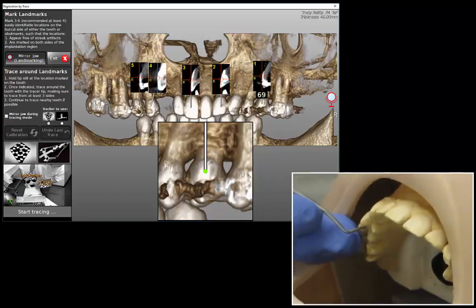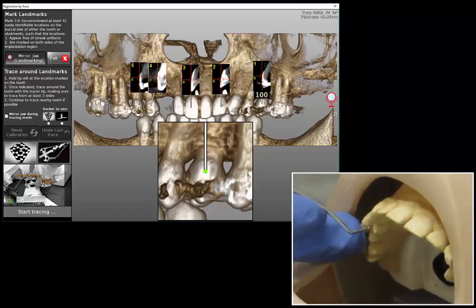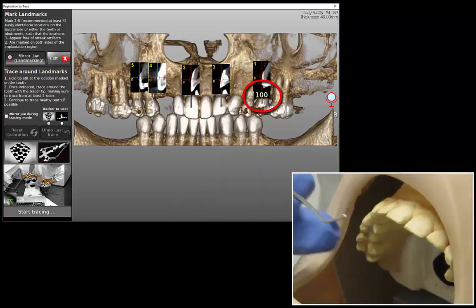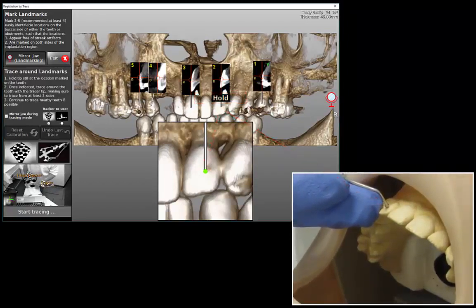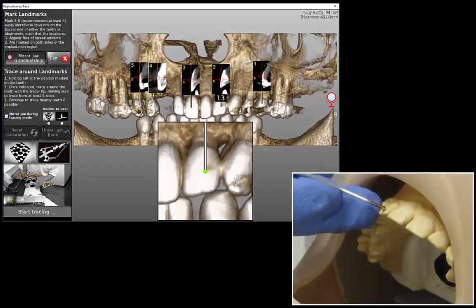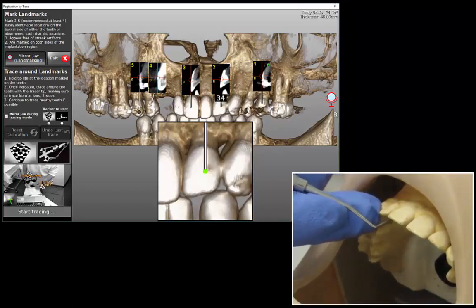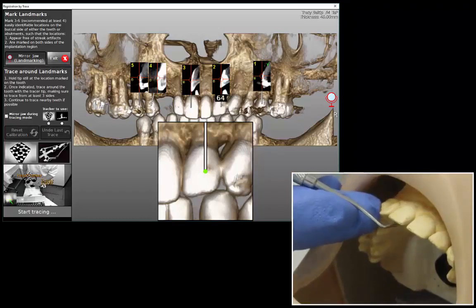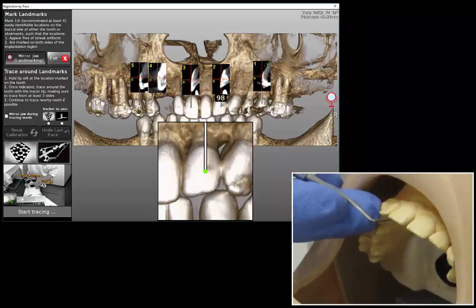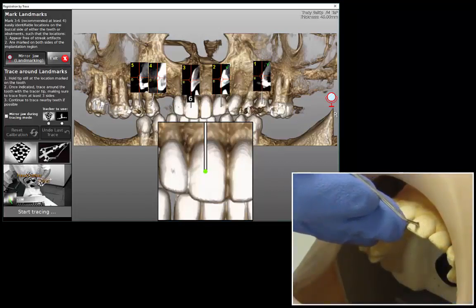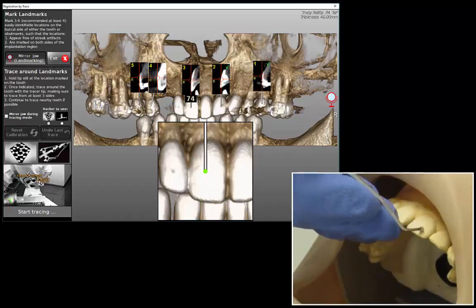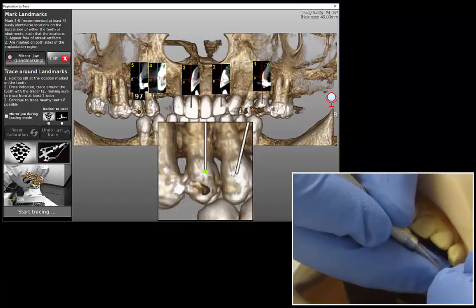I now start tracing by sliding the ball tip over the surface of the tooth. As I trace, Navident collects points — that's the sound you hear. A specific sound indicates that tracing on the tooth is done, as 100 points have been collected. Moving over to the second landmark, the same sequence repeats: I hold the tracer in place, get the cue, and start tracing. I keep my tracer's tip on the tooth surface at all times, tracing on at least three sides of the tooth — buccal, occlusal, and palatal. Moving over to the third landmark, I pass from buccal to palatal over the incisal edge, tracing it too, keeping the ball tip on the surface at all times. I can also continue the tracing on an adjacent tooth. When all landmarks have been traced, Navident indicates it with a special sound, and the registration is performed.